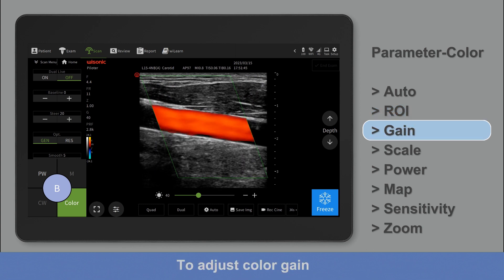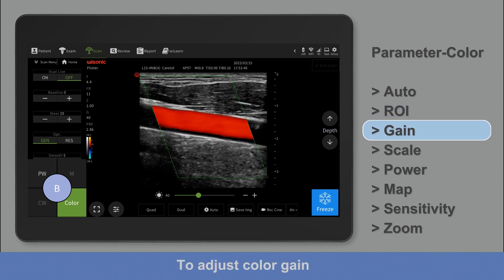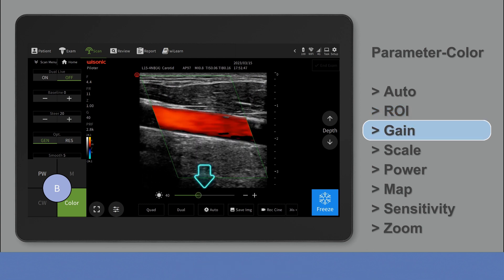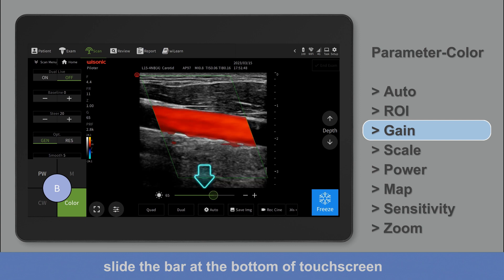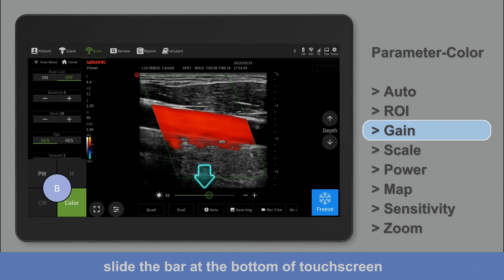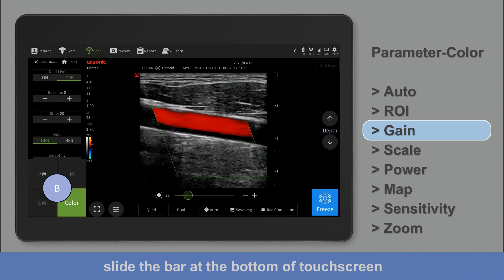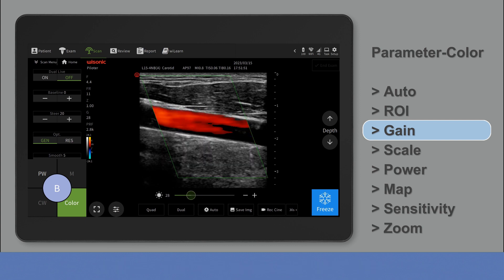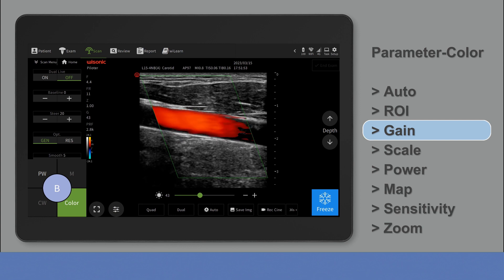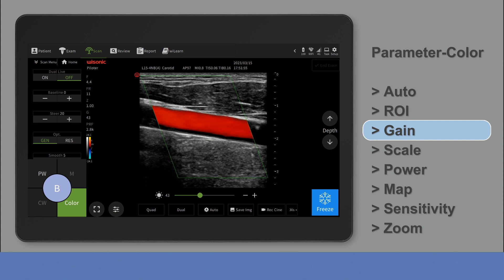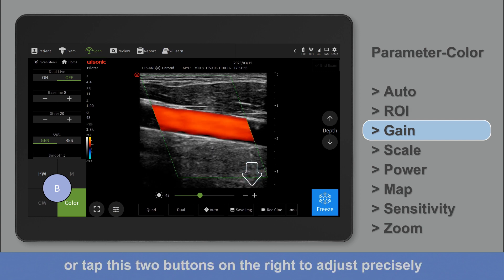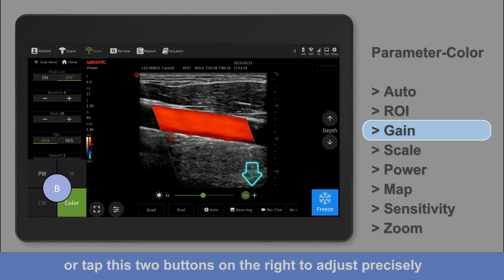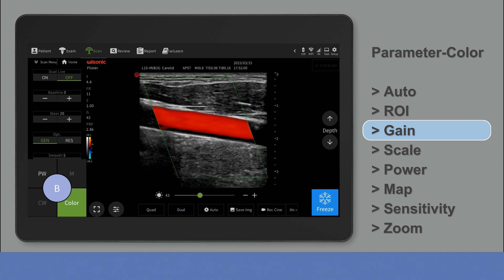To adjust color gain, slide the bar at the bottom of the touch screen. Or tap the two buttons on the right to adjust precisely.